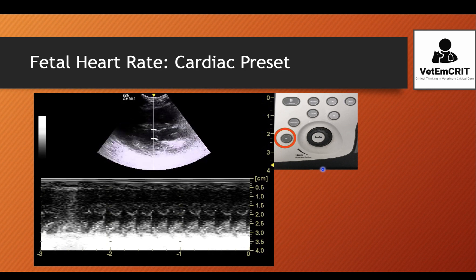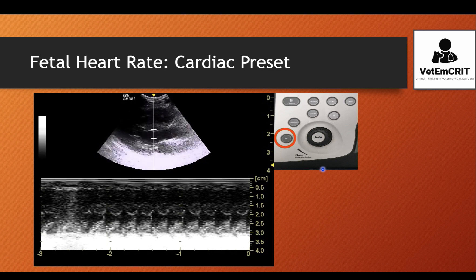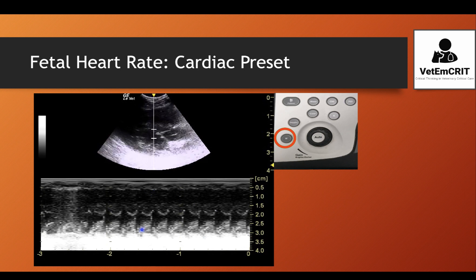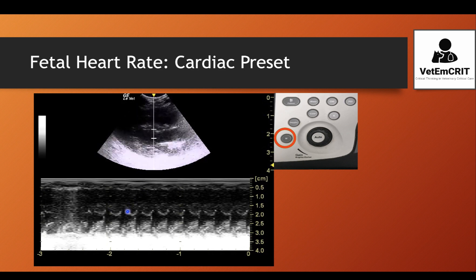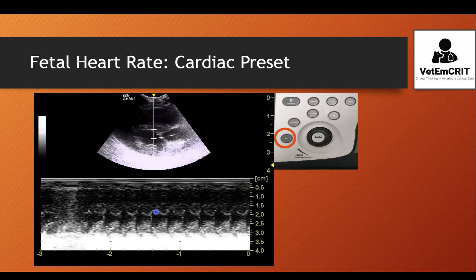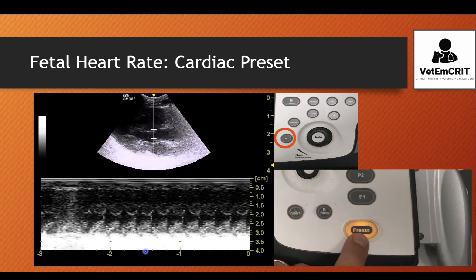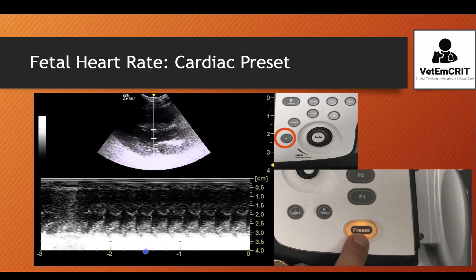M-mode stands for motion mode — it allows an operator to evaluate motion in a still image, as depicted on the bottom picture. Once you turn on M-mode, you want to put the cursor across the heart so that you can see different phases of the heartbeat in M-mode below. Next, freeze your image so that you can assess the heart in M-mode as a still image.